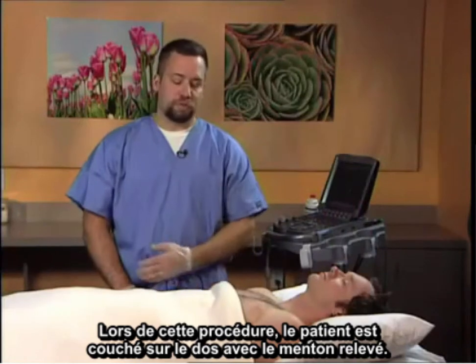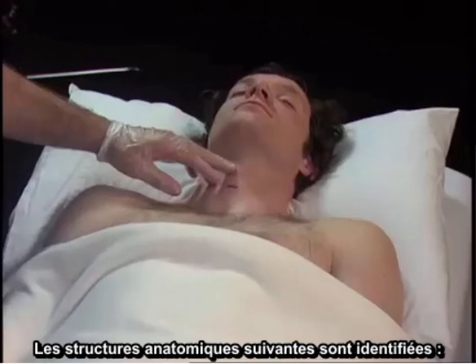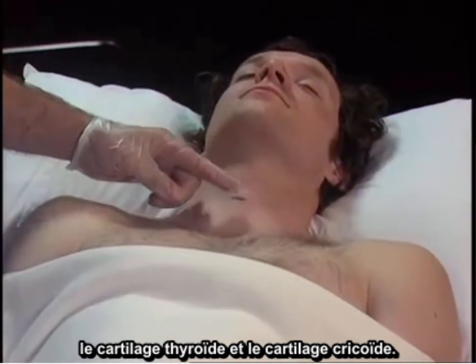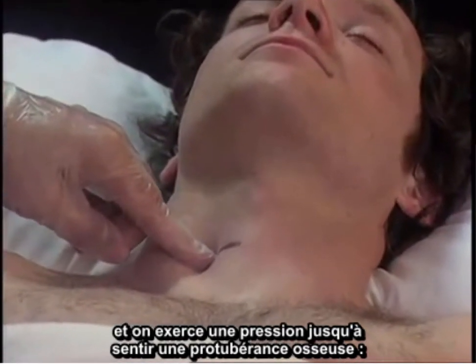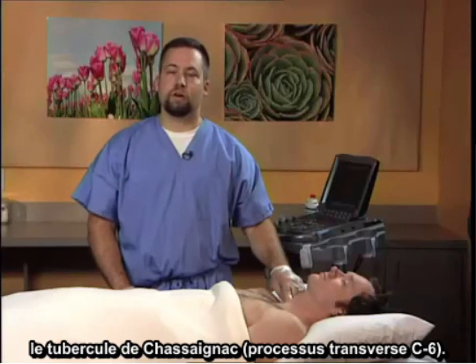The procedure is performed with the patient in the supine position with the chin up, and the following anatomic structures are identified: the thyroid cartilage, the cricoid cartilage, and then the finger is placed in the groove next to the trachea and pressure applied until a bony protuberance is felt. This is Chasniak's tubercle, or the transverse process of C6.